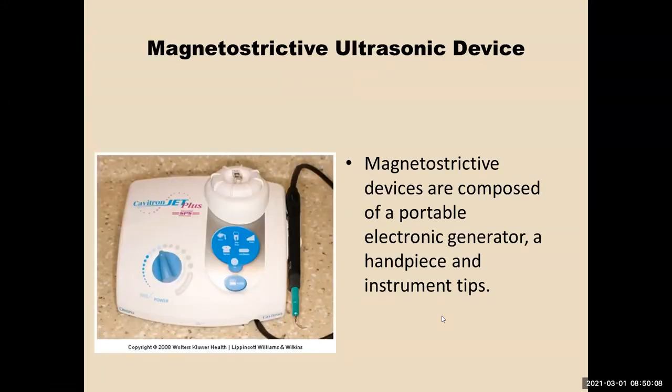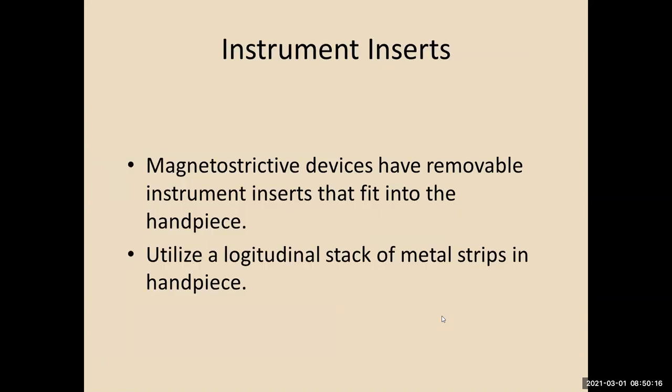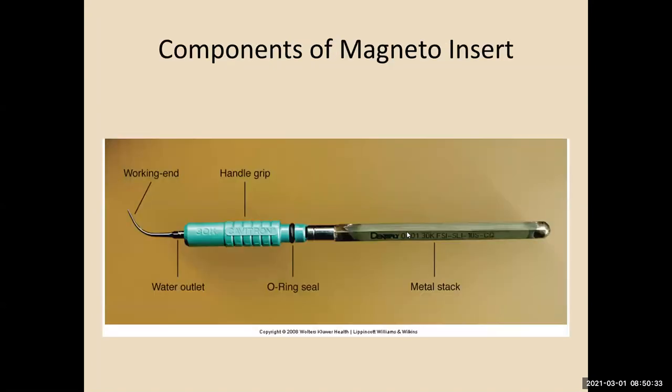Magnetostrictive devices are composed of an electronic generator, a handpiece, and instrument tips, just like the piezo. Magnetostrictive devices have removable instrument inserts. These are inserts, not tips, that fit into the handpiece. And they have longitudinal metal strips. This, my friends, is what you have to protect with your life.